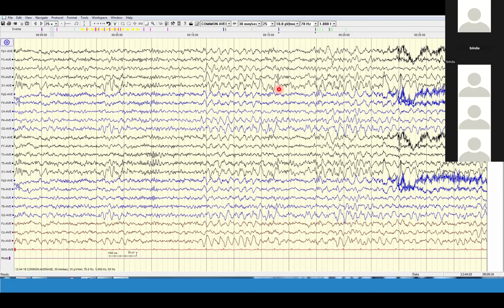And in acute conditions, EEG might be used for supporting the diagnosis of metabolic or toxic encephalopathy. And of course, it will help you to rule out nonconvulsive status. So the main indication in practical scenarios is to rule out nonconvulsive status and support your clinical diagnosis. Apart from that, it is specific for some conditions, where the EEG says that this is the signature of this condition.